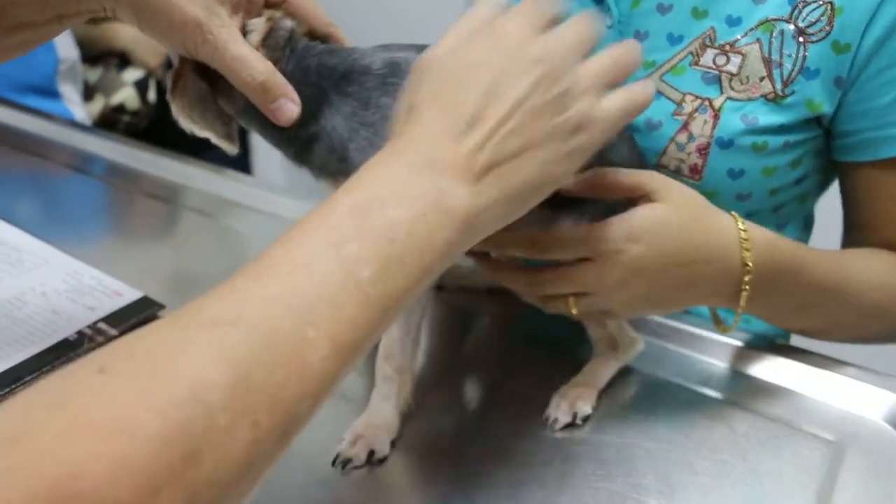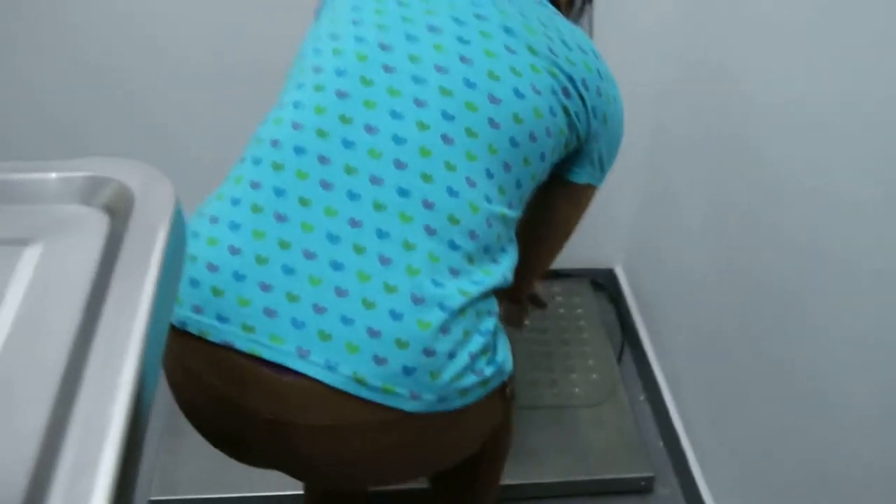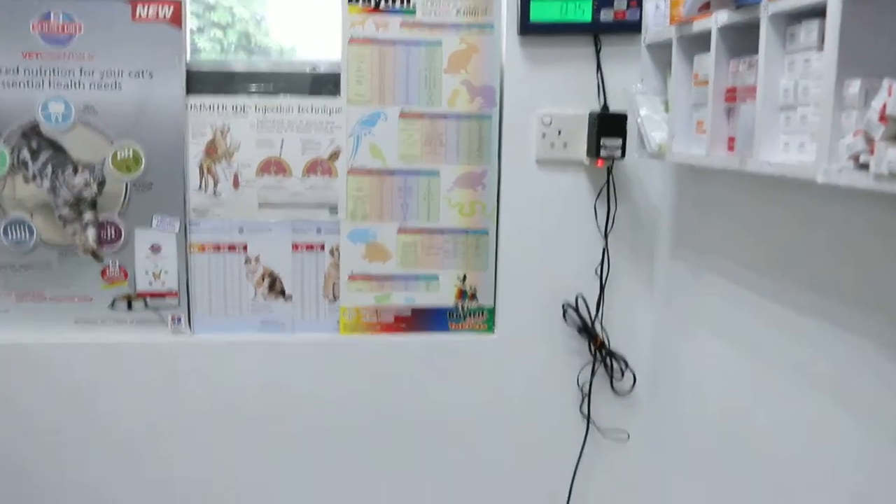The first thing of course is we weigh the dog. So we weigh the dog — that's important. Every patient must be weighed.